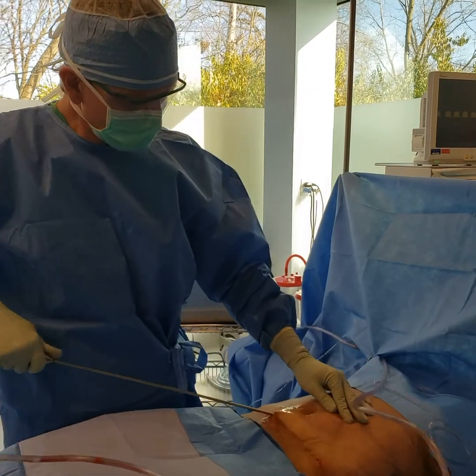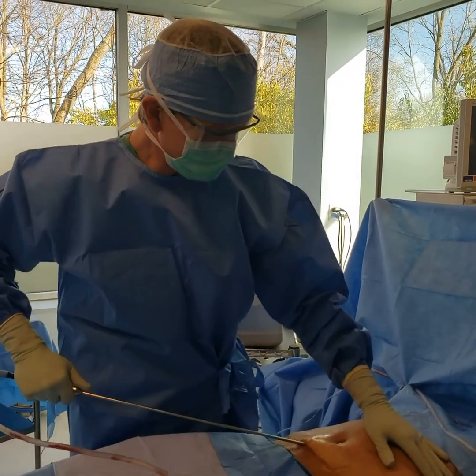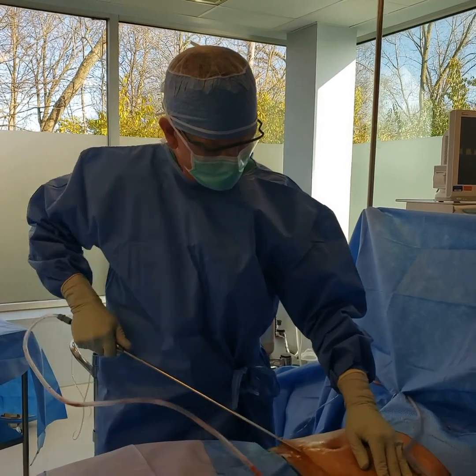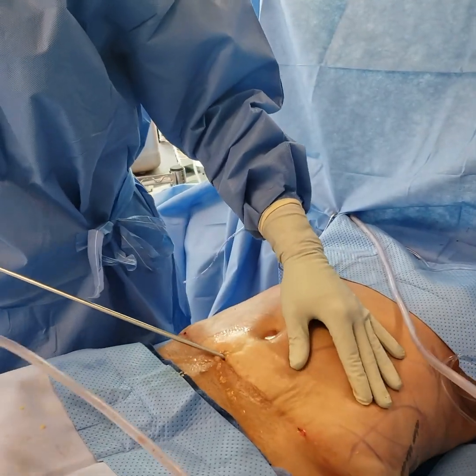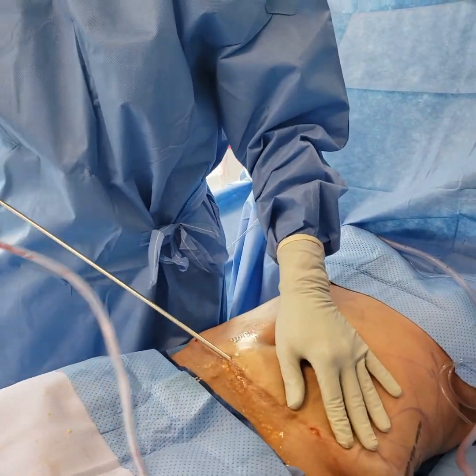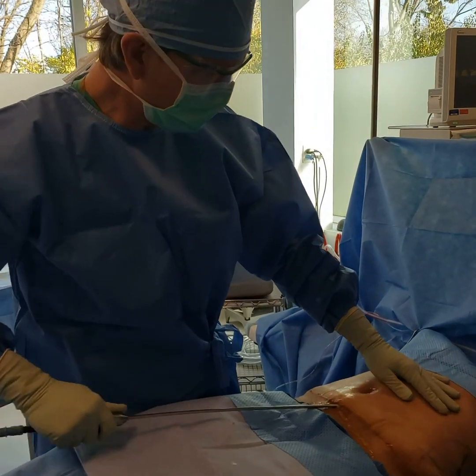And then once we get that done, we're going to go back and we'll actually do the real liposuction. But this is important to help make it smooth. And you can kind of see as I'm passing through that it's got some resistance. And that's from the previous liposuction, also from the scar tissue from the abdominoplasty. And this will just help when we get all released to remove that tissue without getting any scar irregularities from it.